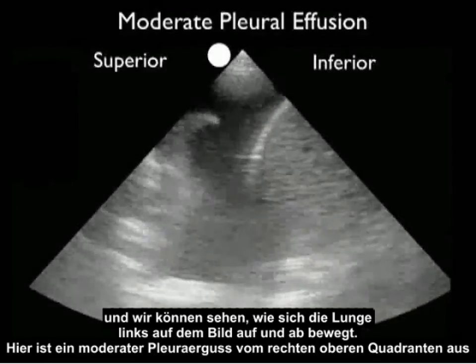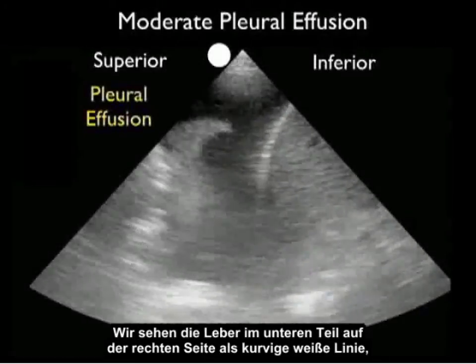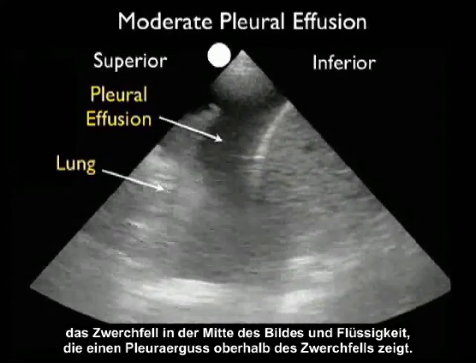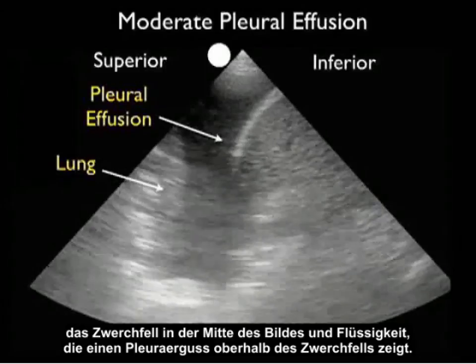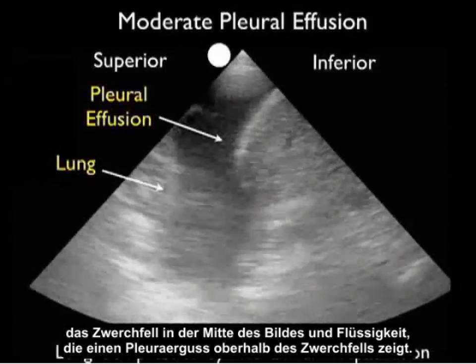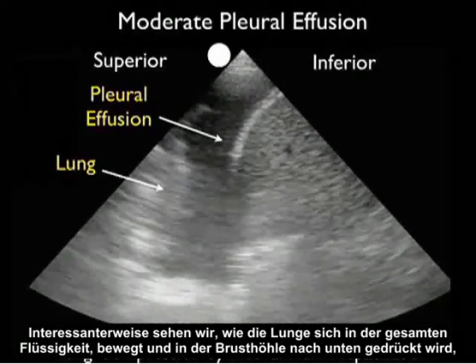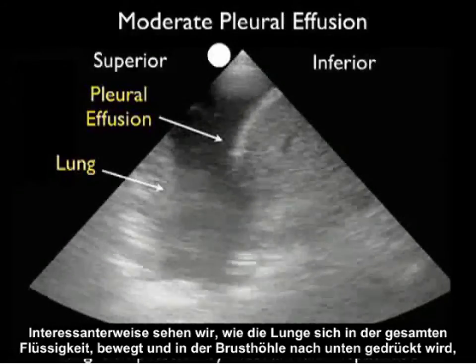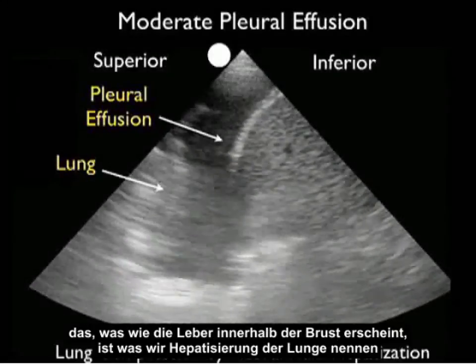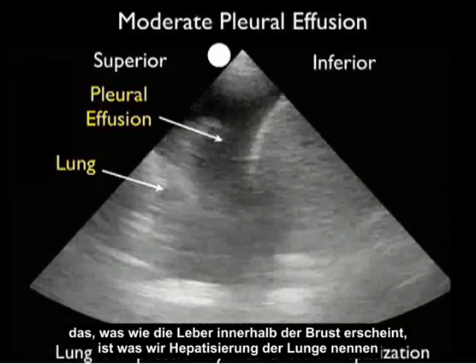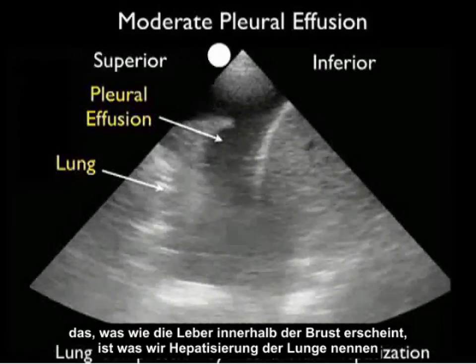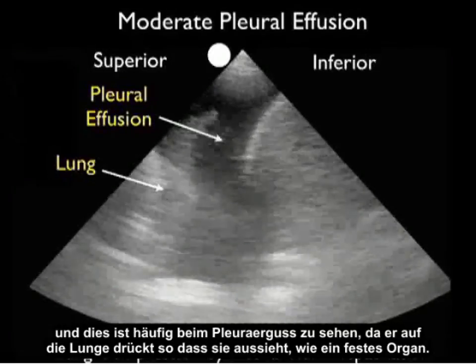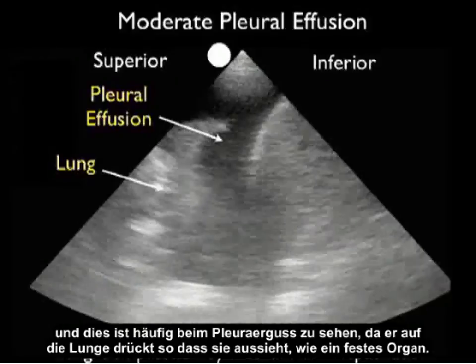Here's a moderate pleural effusion as taken from the right upper quadrant view. We see the liver to the inferior aspect, the curving white line making up the diaphragm in the middle of the image, and fluid representing a pleural effusion superior to the diaphragm. Interestingly, we see the lung moving around in all the fluid, compressed down by the fluid within the chest cavity, taking on what appears like a liver within the chest — something called hepatization of the lung. This is commonly seen with a pleural effusion as it pushes in on the lung, making it more of a solid type organ.